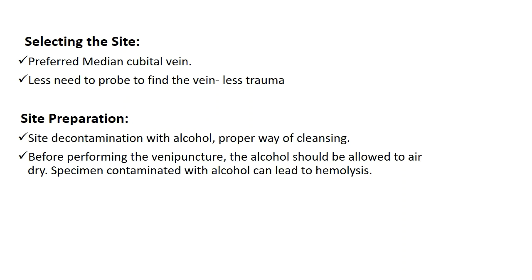So there is a proper way of cleansing, either in a circular fashion from central to periphery, or in a longitudinal fashion from central away to the periphery. Okay. Before performing the venipuncture, 70% alcohol should be used only, and that should be allowed to air dry. Why? If the alcohol remains in that wet area and you prick, the alcohol will contaminate the needle, and that alcohol will hemolyze the blood.